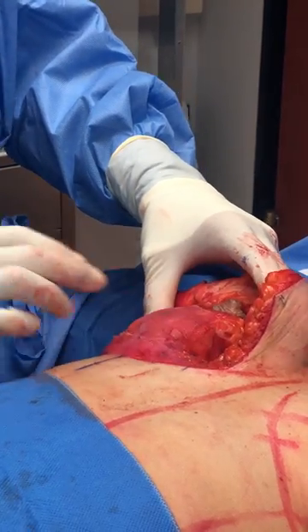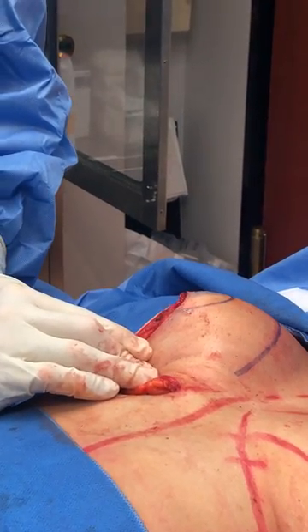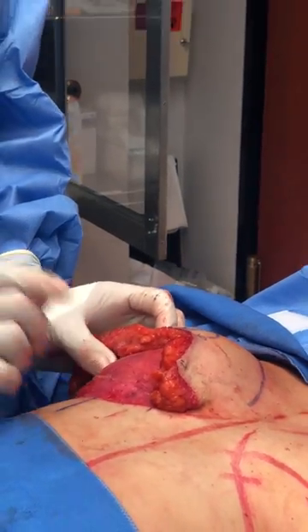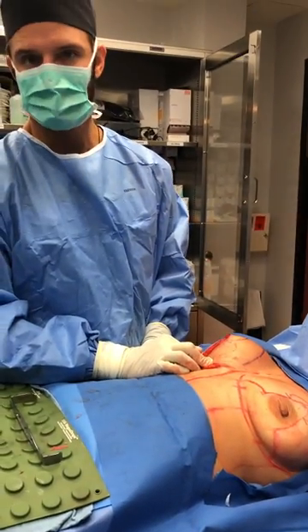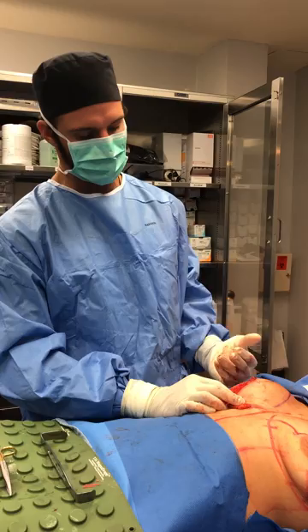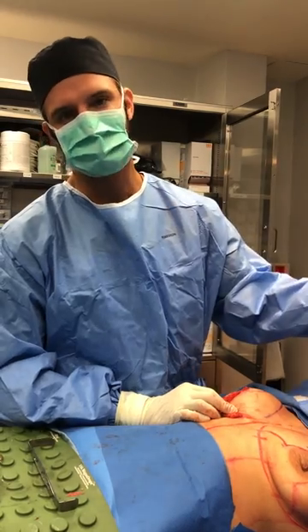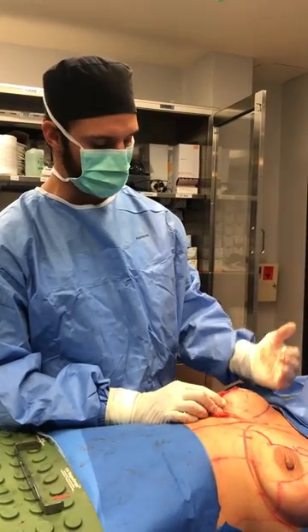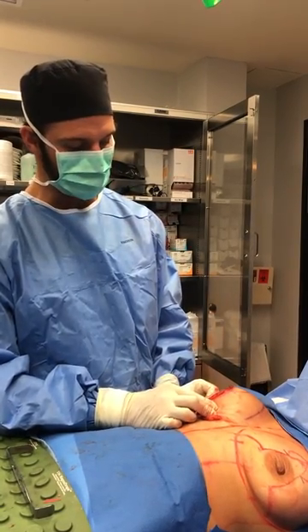What this does is it actually incorporates into this tissue, and as we bring that around, you can see it's going to create a nice perky breast without an implant. It's going to give more longevity — not dropping and bottoming out and creating a droopy breast again. It's almost like cheating: giving you a nice implant-looking result without using an implant. That was what this patient did not want. From what the literature shows, it actually produces increased perkiness long-term, and this is something that a lot of us plastic surgeons are using to give patients an added advantage with breast lifts. It can also be used with implants in a lift.